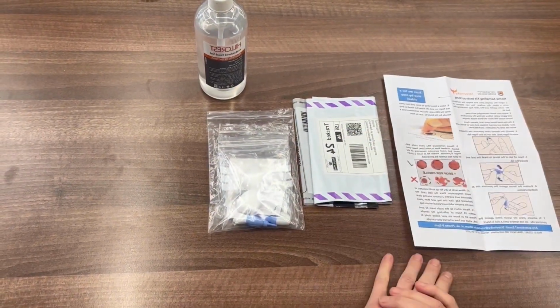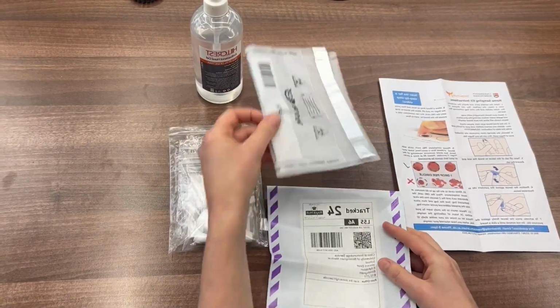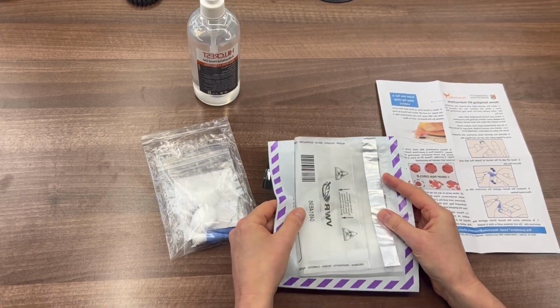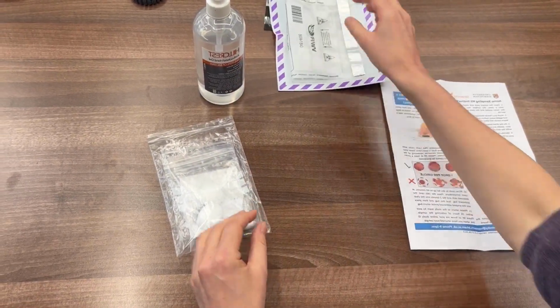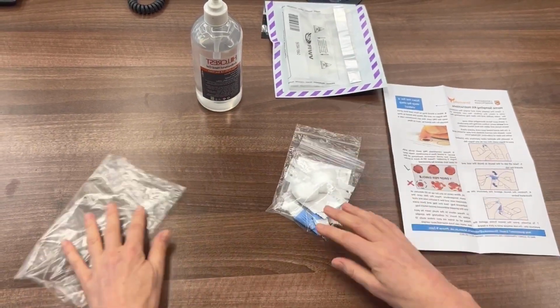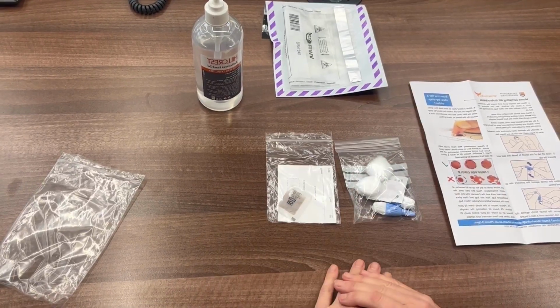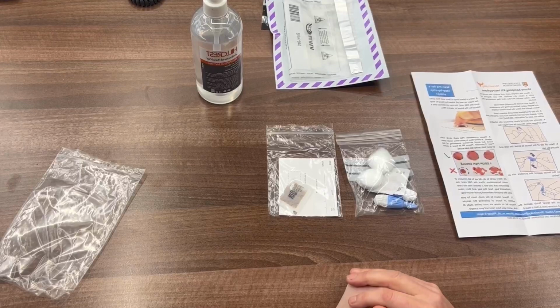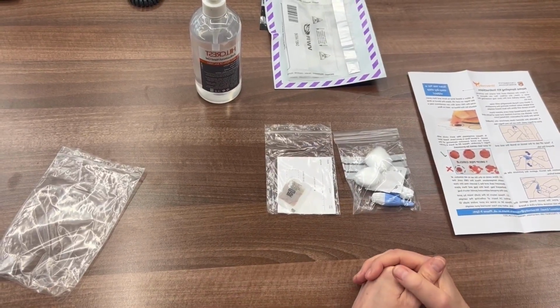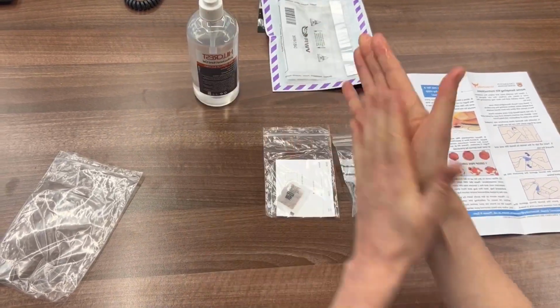Here is your home sampling kit. These are prepaid envelopes for returning your sample, which we can put aside for now. And here is the equipment you need to undertake your dry blood spot test. So the first thing I'm going to do at this stage, now we've unpacked it, is wash our hands. I don't have a hand wash here, so I'm just going to use some alcohol gel.